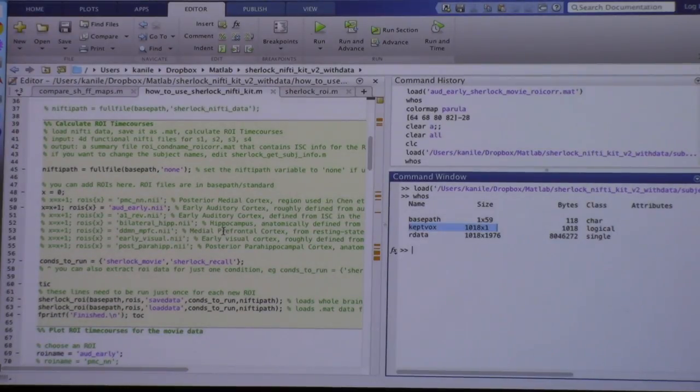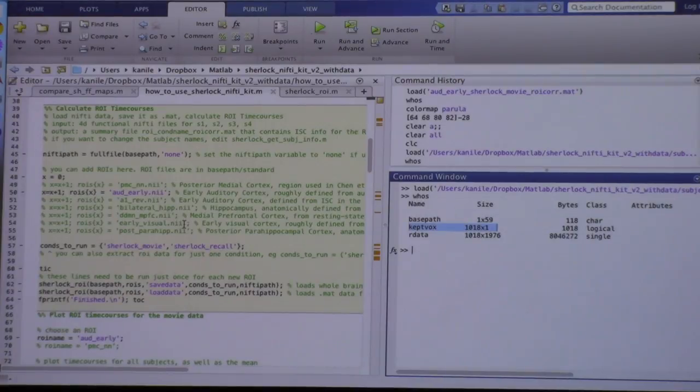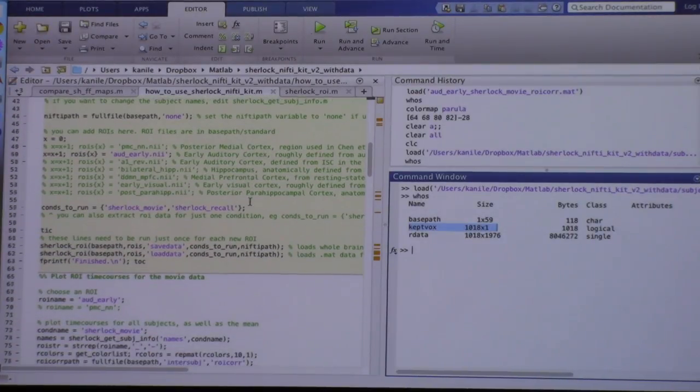I don't know how that's handled in standard fMRI analysis packages, actually. For people using Python, the Nilearn library has a compute brain mask function that does the percentile threshold. It does. Okay, great. Cool.